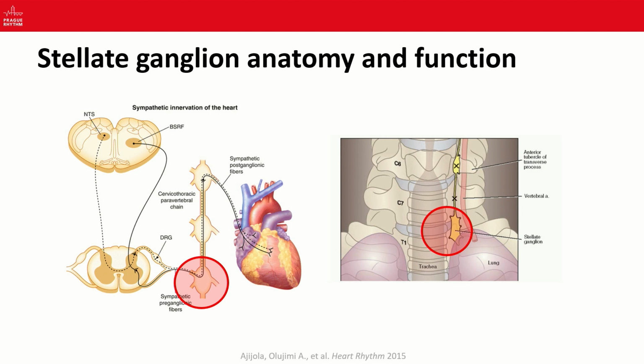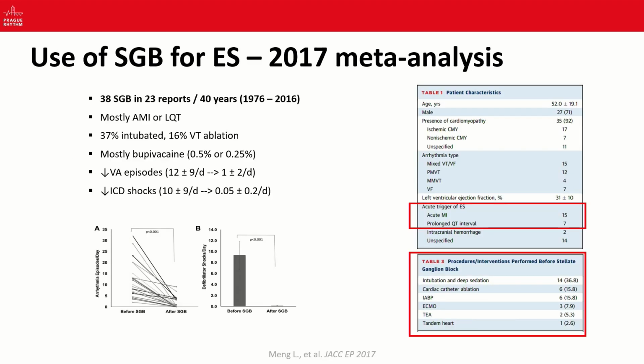Nevertheless, until 5 years ago, this procedure was used only very rarely to manage electrical storm. And this is documented by a meta-analysis from 2017, which included 38 procedures, which were, however, collected over 40 years. It took 40 years to collect 38 procedures from 23 reports.